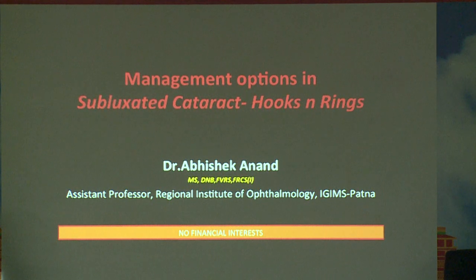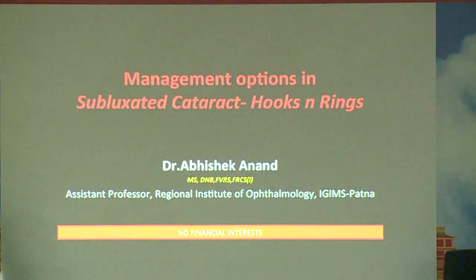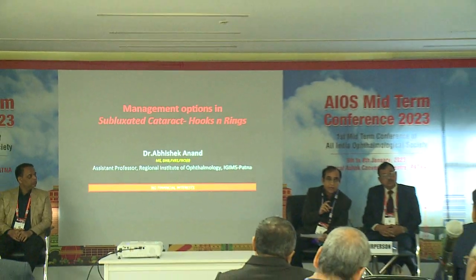So the chances of rexis going to the posterior capsule are very, very remote. I feel that it is always the prolapse of the vitreous forward which will make the rexis go back. If the pressure is from the top and chamber depth is maintained, the rexis will not run away. And he is very right. There is no need to do any supracapsular. In fact, keep the back filled and the rexis will not run away. If you bring things up, there are more chances of the rexis running out.